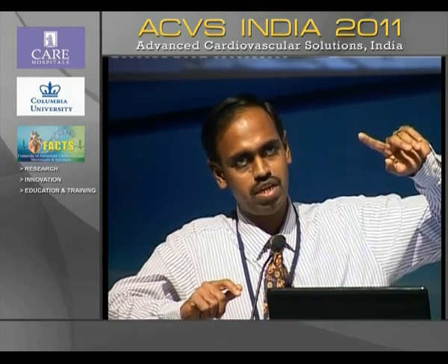This is going to work. But we should remember, if there is a confluent large postero-inferior rim deficiency, imagine the diagrams that we saw, the en face view of the atrial septum. If you have a deficient rim starting from 10 o'clock position all the way down to 5 o'clock position, the entire posterior and inferior rim is deficient. Obviously, none of the techniques is going to work. So you need to choose your patient. You need to identify only posterior rim deficiency or only inferior rim deficiency, it's very likely to work. And this technique is quite useful.